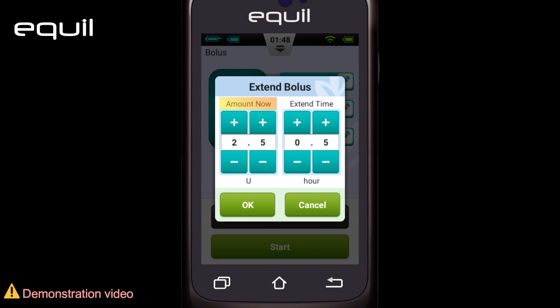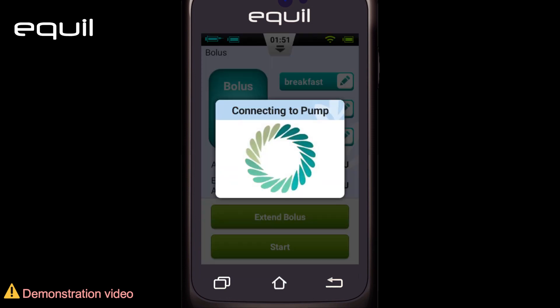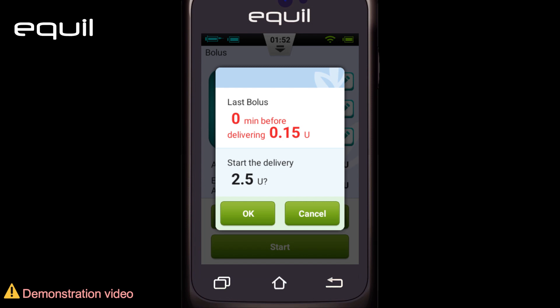For the 'Amount Now,' enter the portion that will be delivered right after starting. This amount will be in absolute units as per the settings made earlier. Afterward, we specify the time during which the remainder of the bolus dose will be administered. Confirm OK. Choose the start button to begin administering the bolus and continue following the same procedure as before.